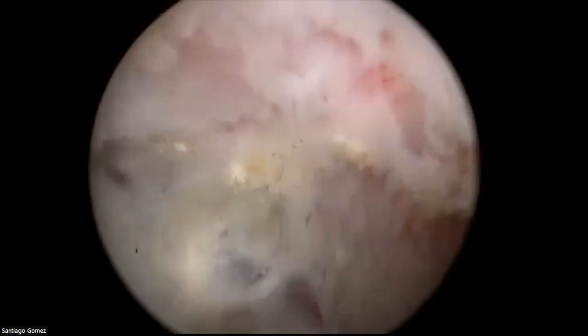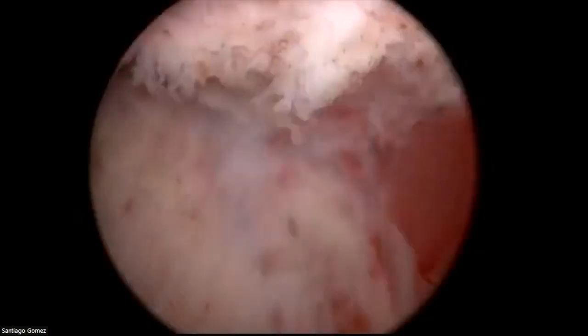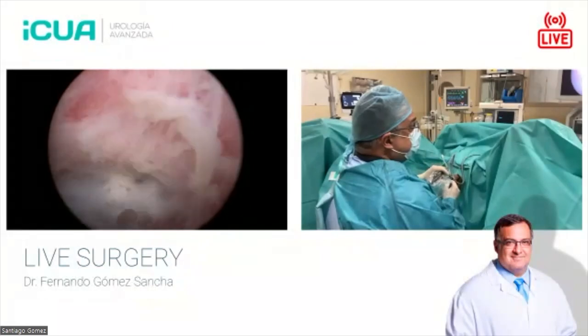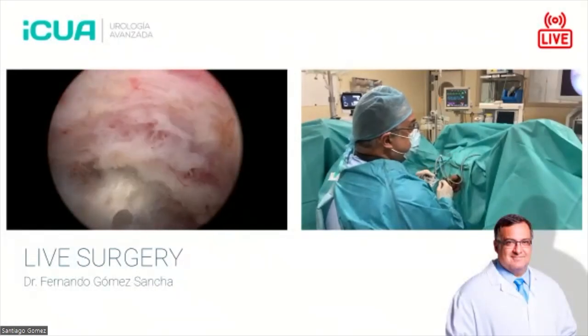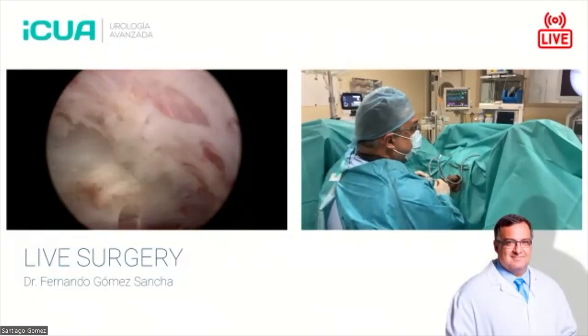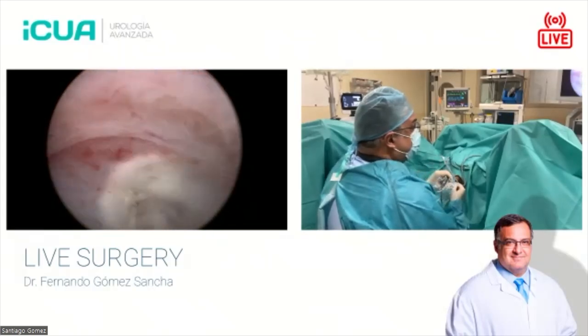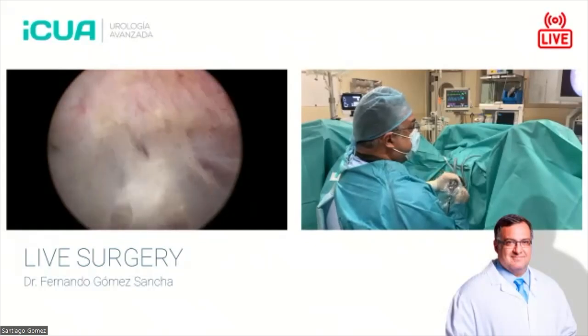I just keep close. But you see, by keeping close, when I get closer, there is a little bit of traction. And then it is the laser energy that does the dissection. It's a very subtle thing, but it's very important, I think, to help you carry out the dissection.